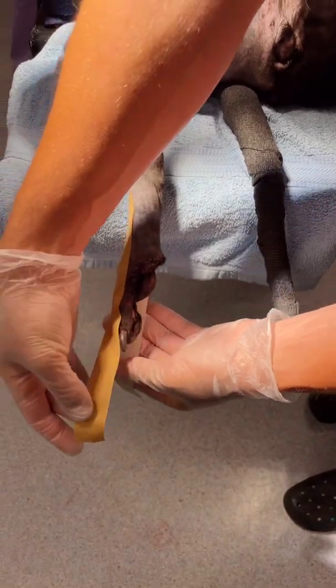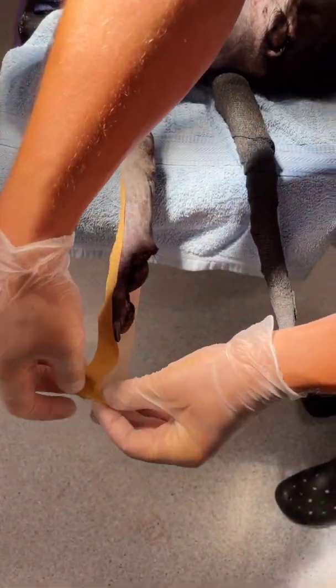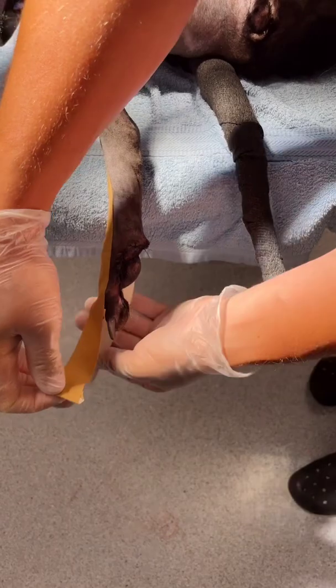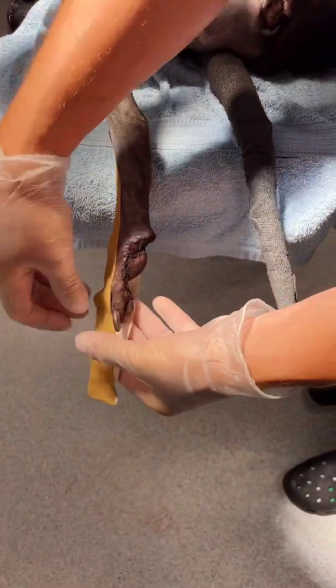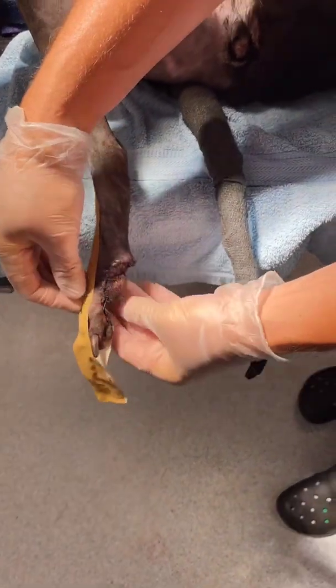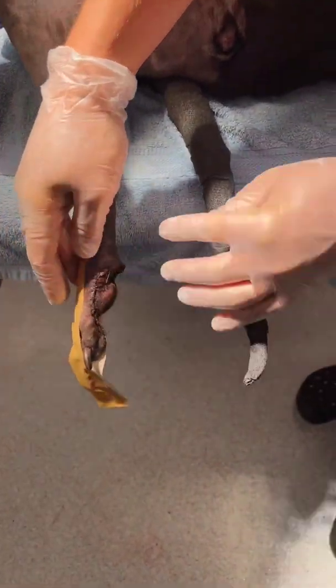Putting the stirrups on, just staying away from the incision. I'm gonna make sure that on the stirrups I put a little tab there so it's easy to undo. I'm gonna leave that on there like that. You can see that we're away from our incision along here.